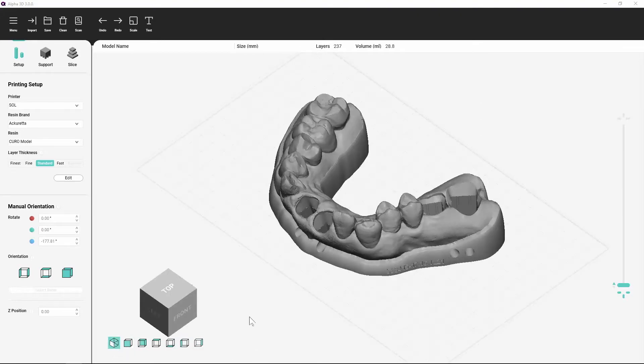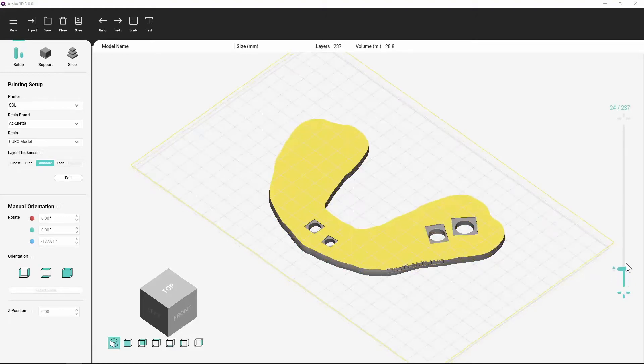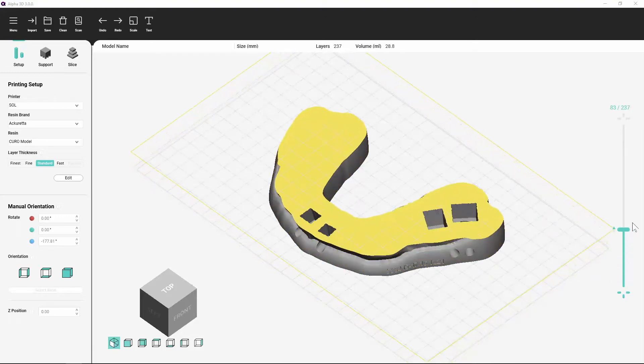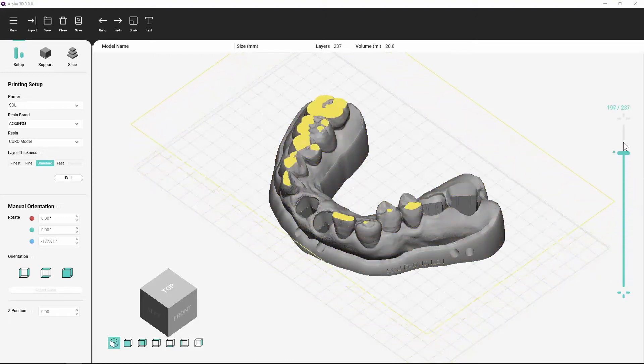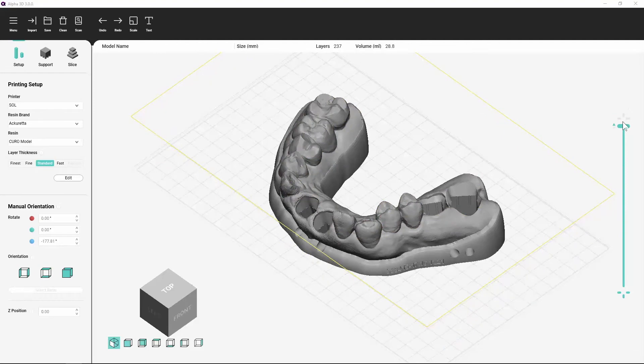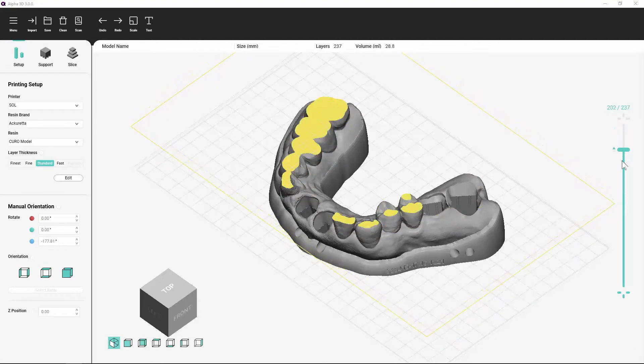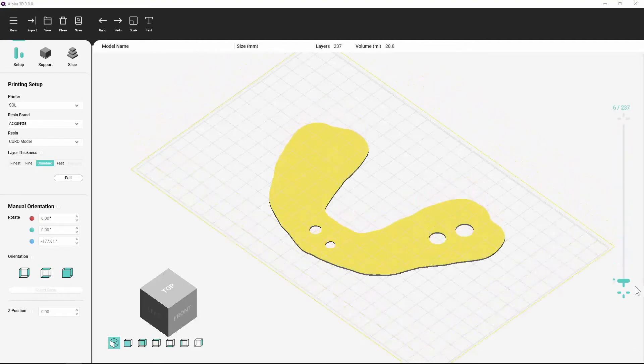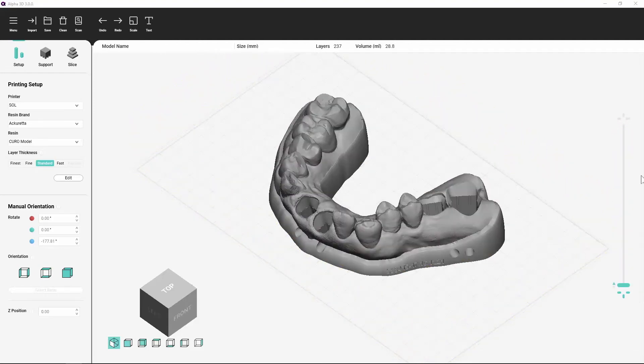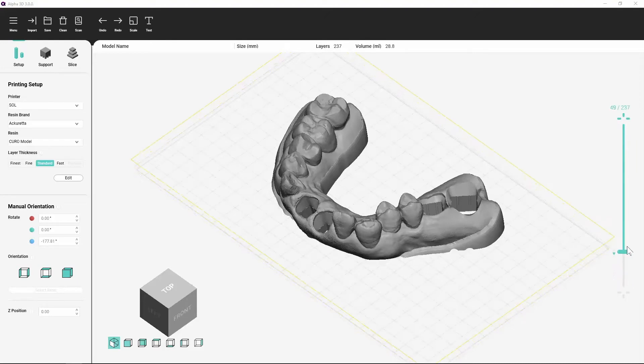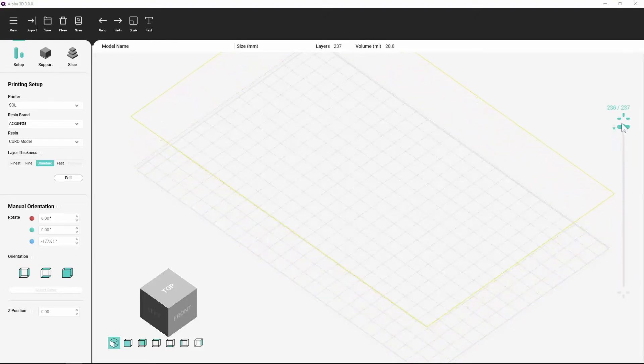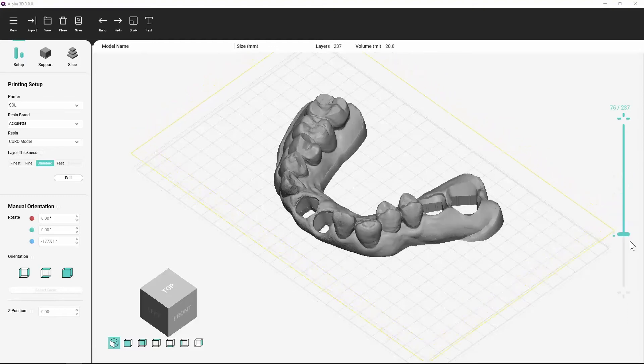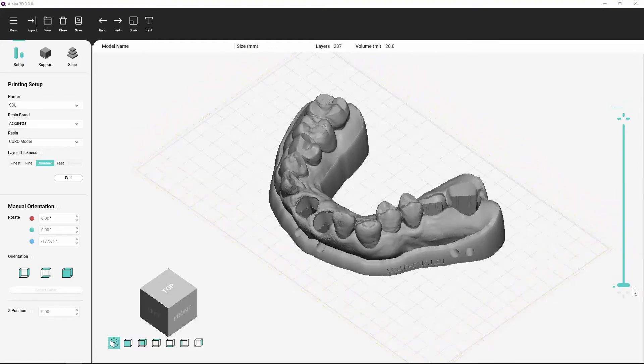Use the view slider to move up and down to a specific level of the model. Click the button at each end of the view slider to change the direction. The arrow adjacent to the view slider handle shows the direction in which each layer appears.